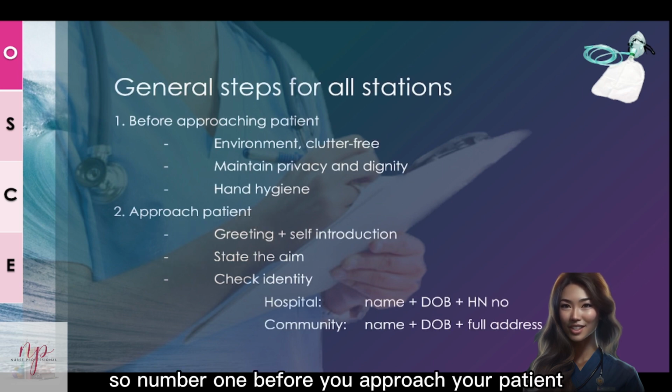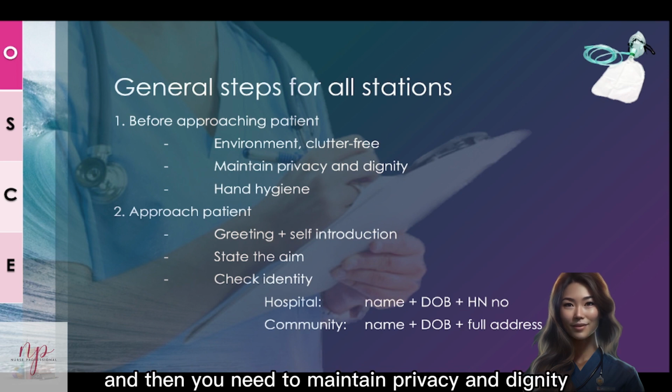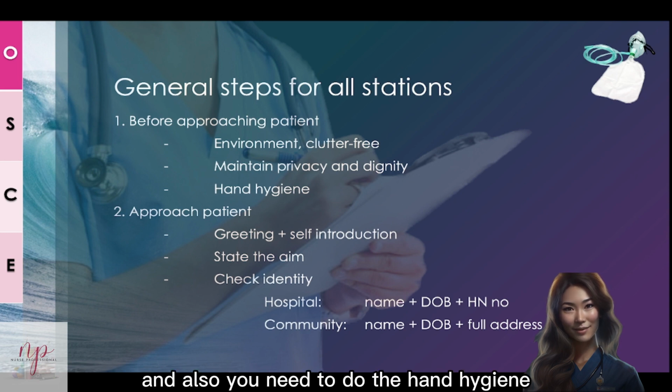So number one, before you approach your patients, you need to ensure that the environment is clean and safe, the floor is clutter-free, and then you need to maintain privacy and dignity by closing the door or closing the curtain. And also you need to do the hand hygiene.